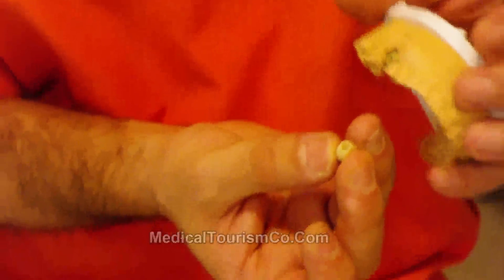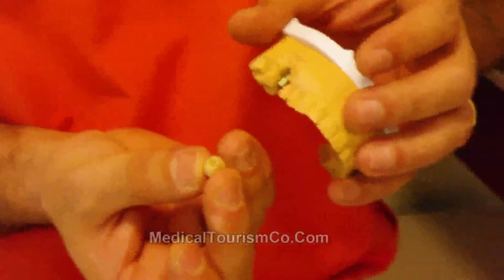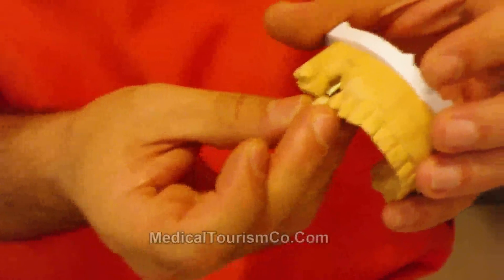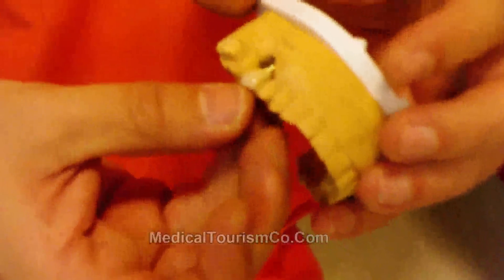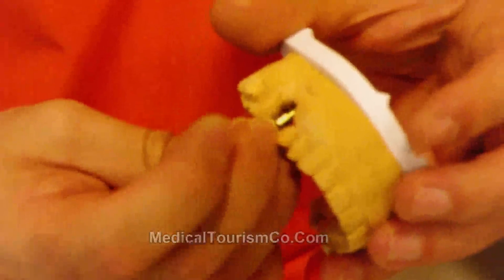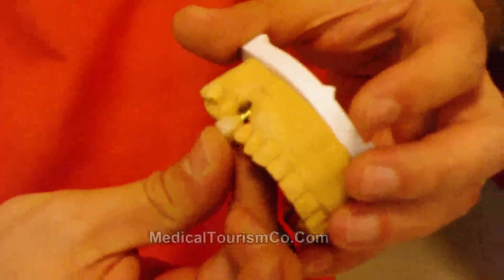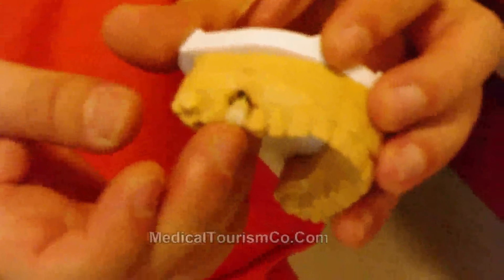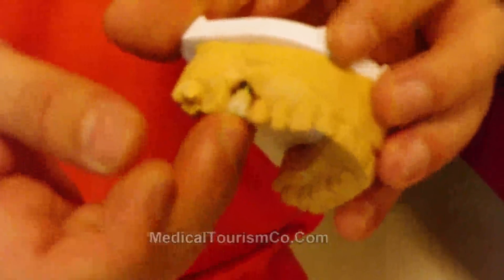The zirconia is a highly biocompatible material and does not include any metallic parts. So there is no corrosion due to the metallic structure. It is a metal-free restoration made on zirconium oxide.